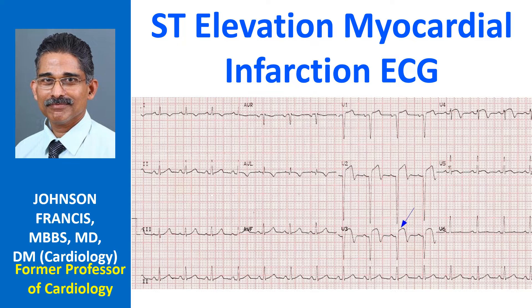ECG shows ST elevation myocardial infarction of the anterior wall. Up-sloping elevation of the ST segment is seen in leads V1 to V5, with maximum ST elevation in V2, which is characteristic of anterior wall infarction.